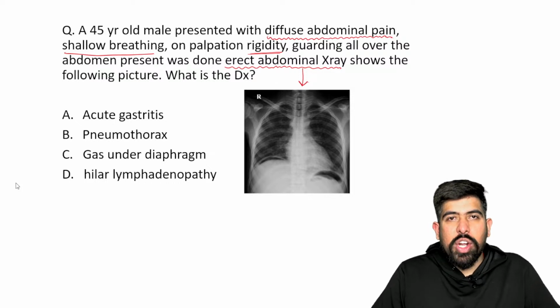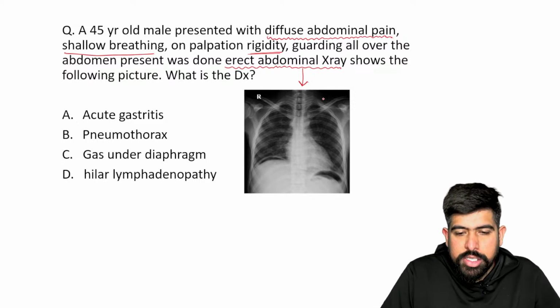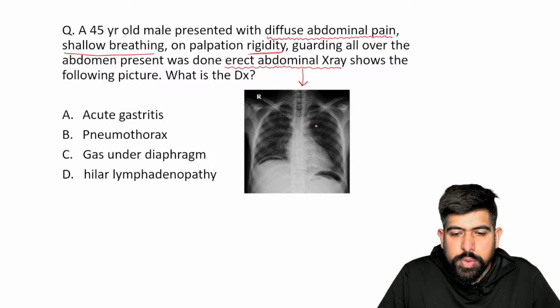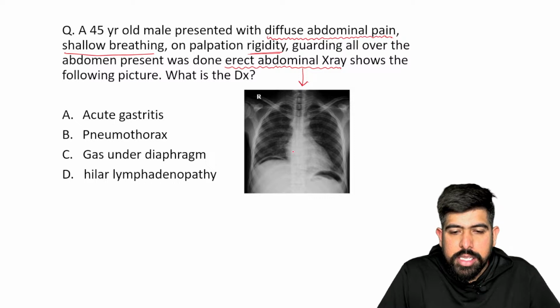The denser a tissue is, the whiter it appears, right? Like bone is dense, so it will be seen in white. You can see this is the heart of the patient, and these are the lungs, but the lungs are seen totally clear. There is no lung pathology seen in this condition.